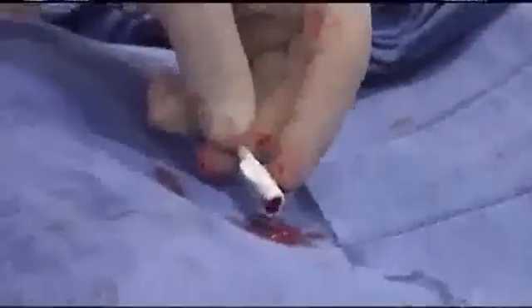See how it pops in? You notice that? Okay, very good. Great. A very important clue that we're luminal, as you can see, is the bleed back from the quick cross. So we know that we're luminal, and you see this flow. And this is a good sign that you're luminal rather than subintimal.